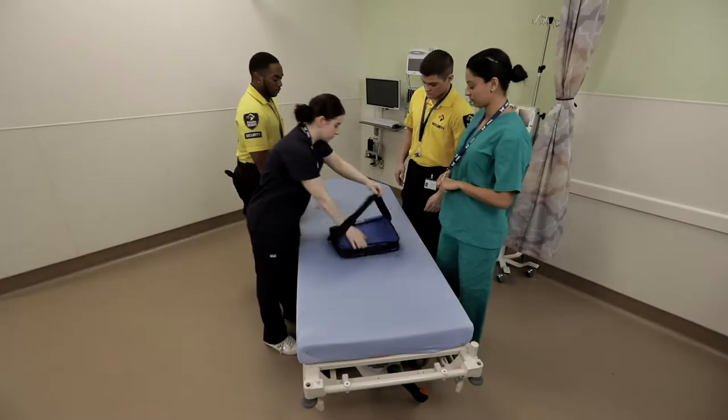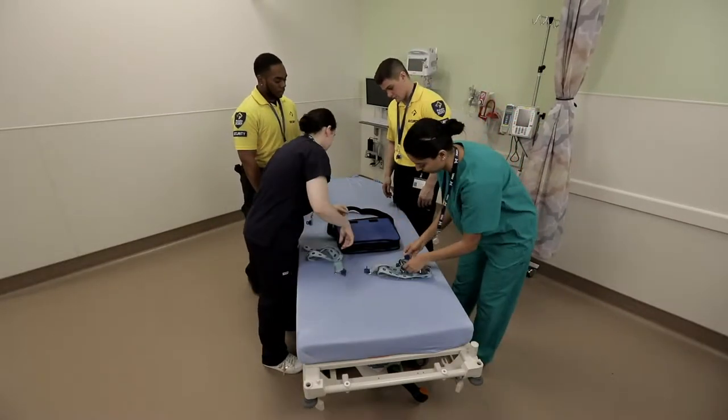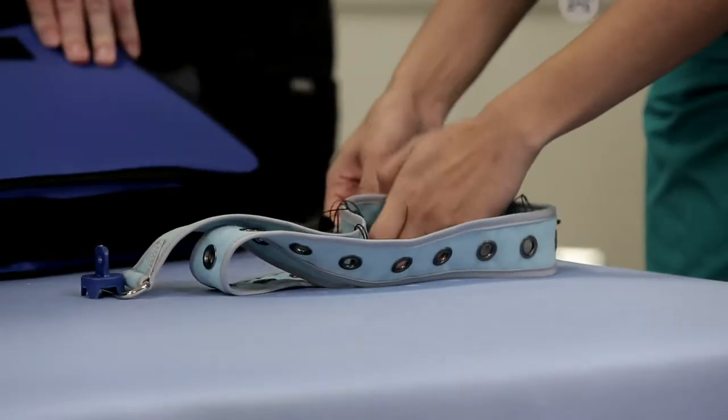For very aggressive patients, Pinnell recommends working with a minimal team of four. Each member attaches a universal limb belt with a lock.